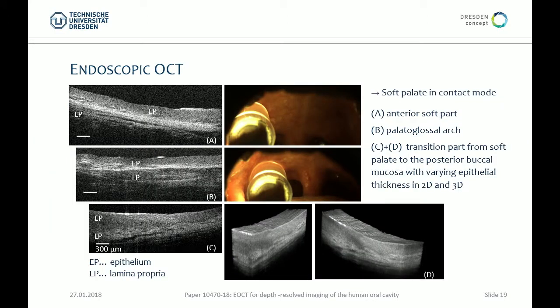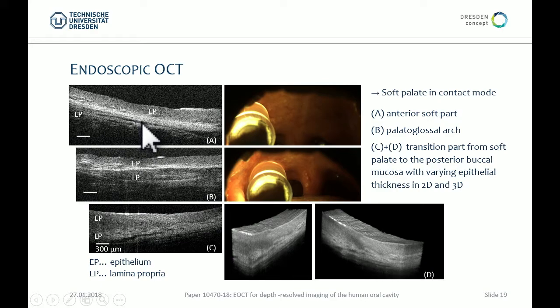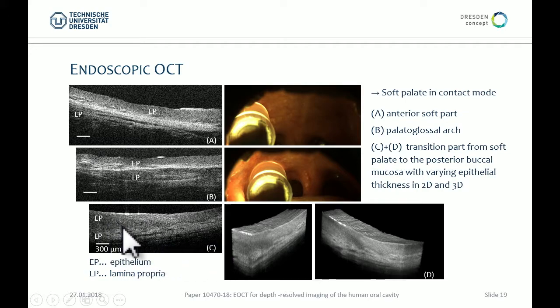Coming to the oral soft tissue — the soft palate and the anterior part of the oral cavity have quite difficult access. With the endoscope we can reach the palatoglossal arch. The epithelium is a homogeneous scattering layer on top, and below you see the collagen fibers aligned towards the hard palate. From the palatoglossal arch the structure is not as dense, and the architecture differs towards the buccal mucosa.